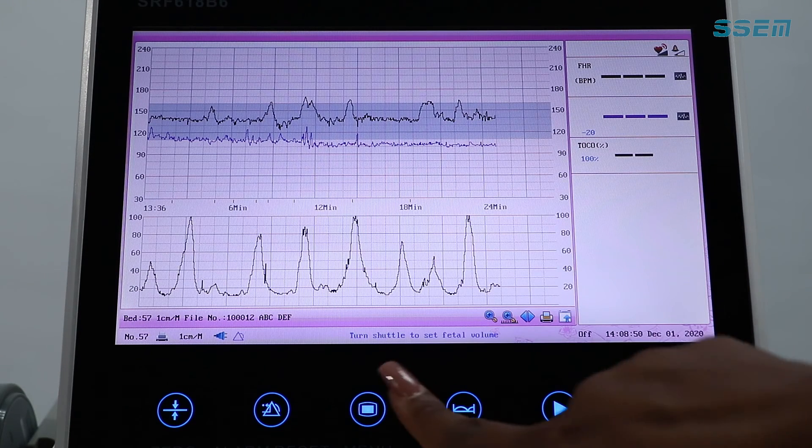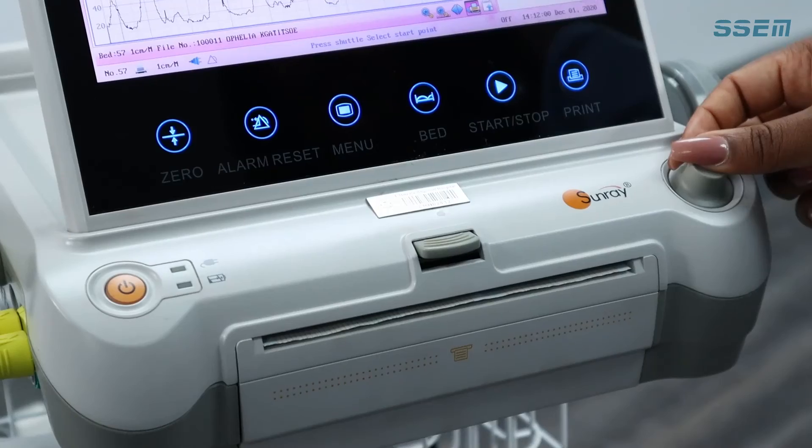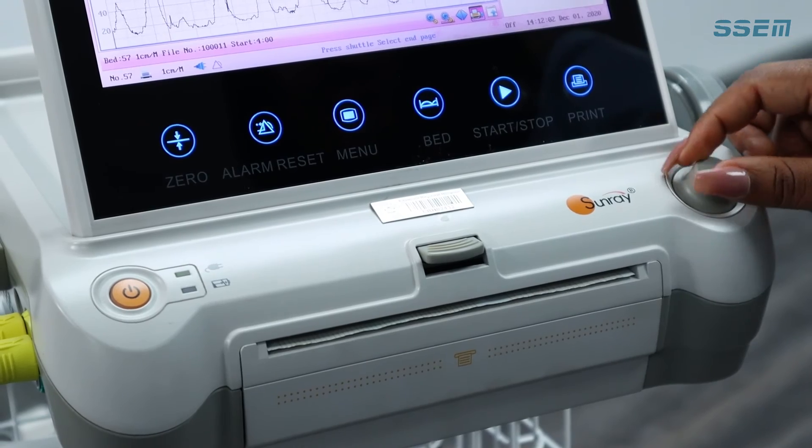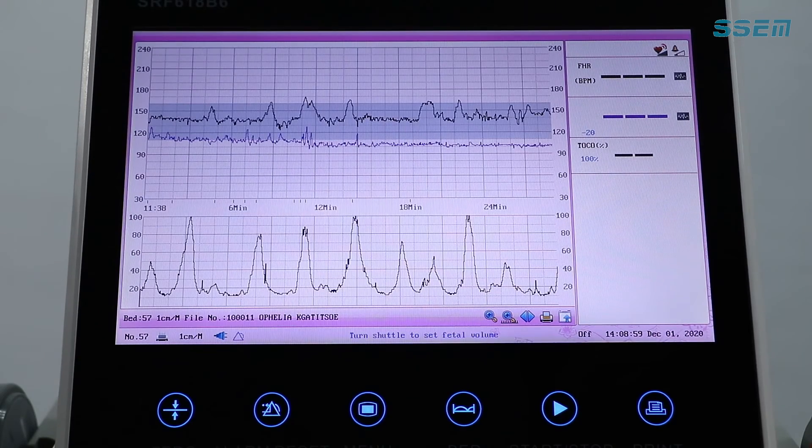This means you can always load old files and print out your tracing again. So you do this by press menu, load files, pick a file you would like to see again by rotating the control knob and highlighting it in green, confirm and print.